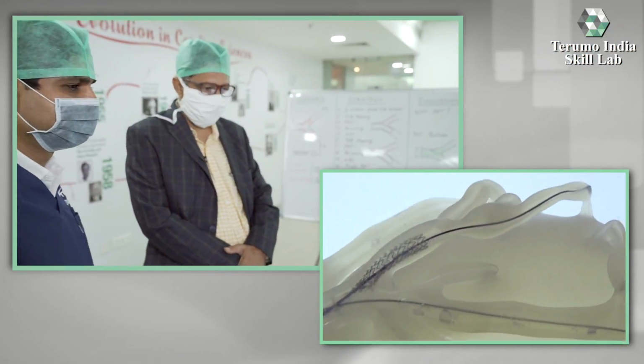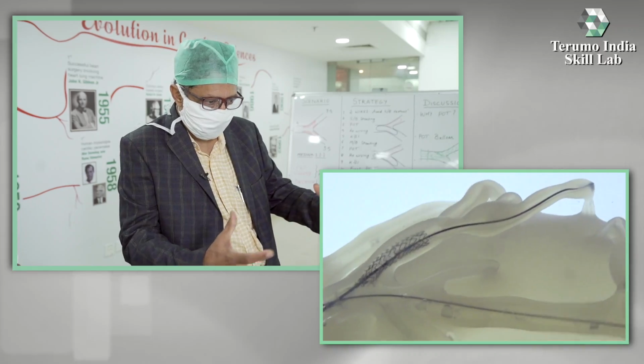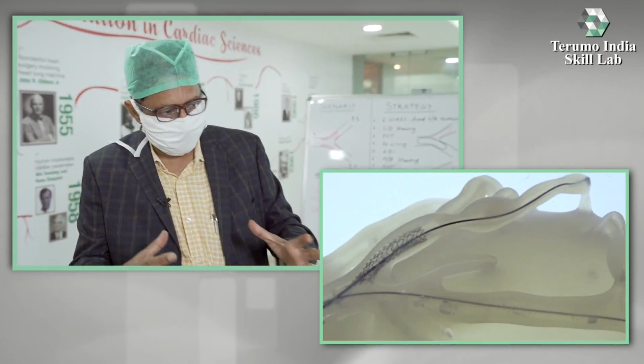So your side branch is actually 3, and you see how well it is flared. The carina also is, the metal is just at the carina. So when you put a second stent, I think the carina will be having minimal metal. So minimal metal load at the carina is the objective.